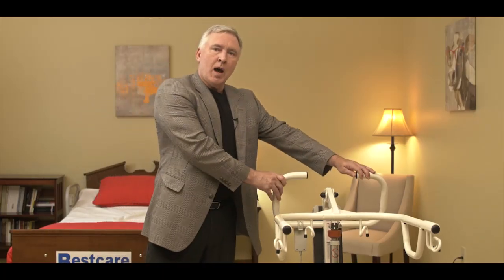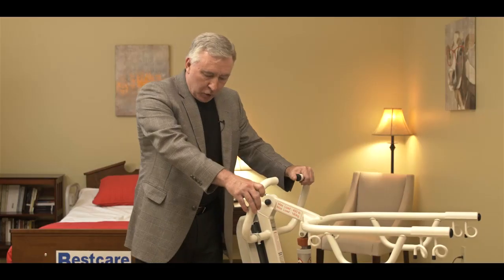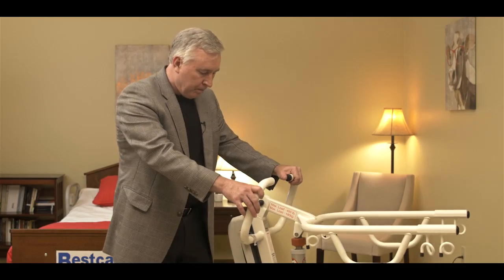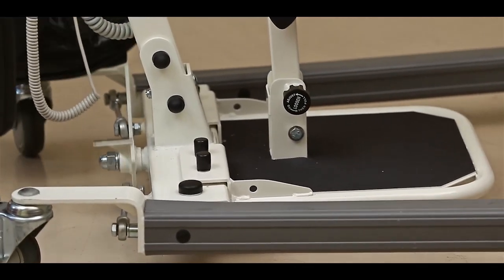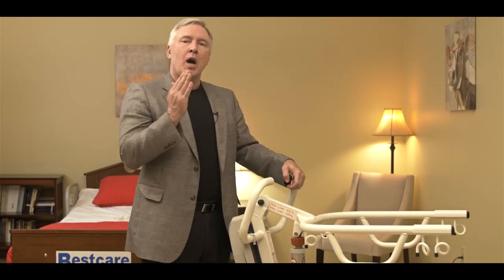Now let's go ahead and show you how to operate the lift. You can see that the lift rolls around on four wheels. We've got two locking casters in the back — push the tab to lock, push it again to unlock it. The base opens and closes with a foot pedal. Pushing it one direction opens the base, pushing the other direction closes it. We'd open up the base to get around a wide piece of furniture or a wheelchair, and close it back down to make it easier to roll around in the room when the patient is in the lift. The locks are only used when you're raising the patient up.